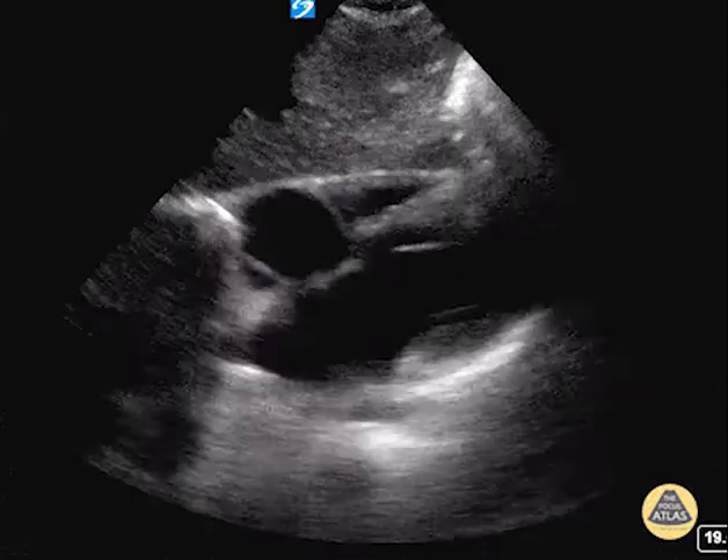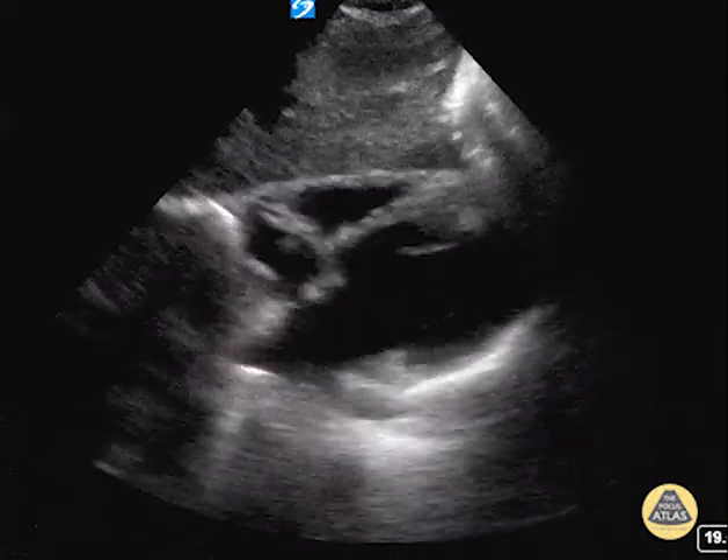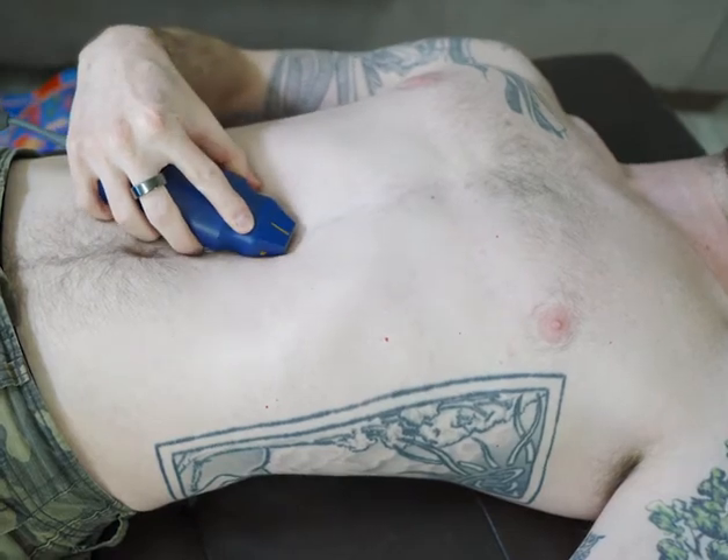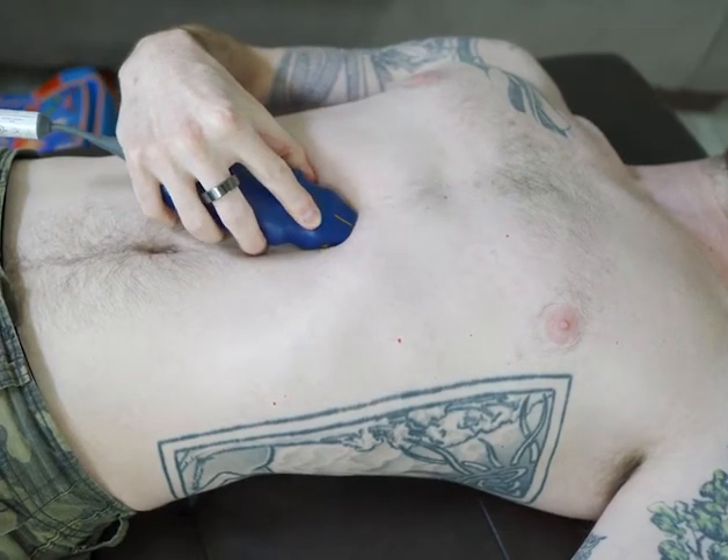This clip demonstrates the subxiphoid view of a normal heart. To obtain this view, place your phased array probe on the epigastrium, a few centimeters inferior to the xiphoid process.